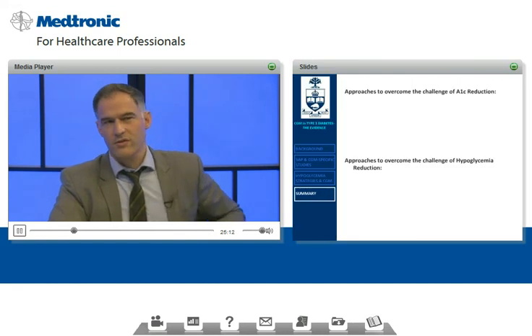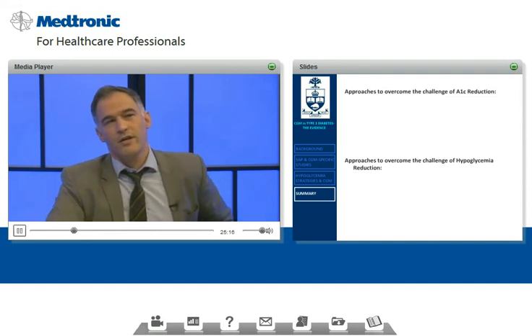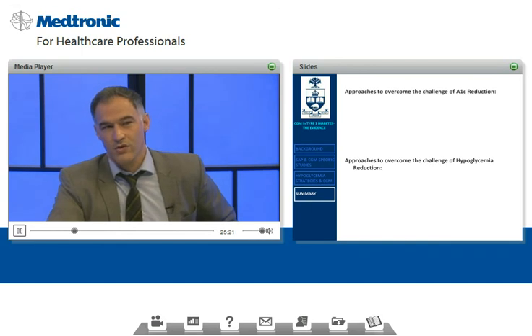So there's the evidence. So we can summarize, I think I'm on time, with the approaches that overcome the challenge of A1C reduction and the approaches that overcome the challenge of hypoglycemia reduction.